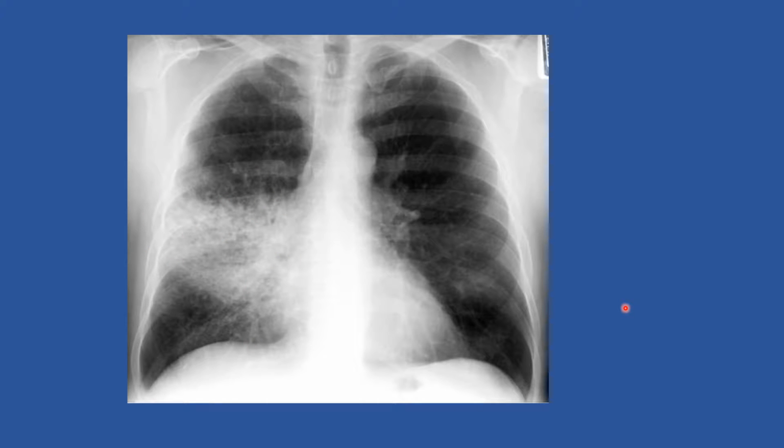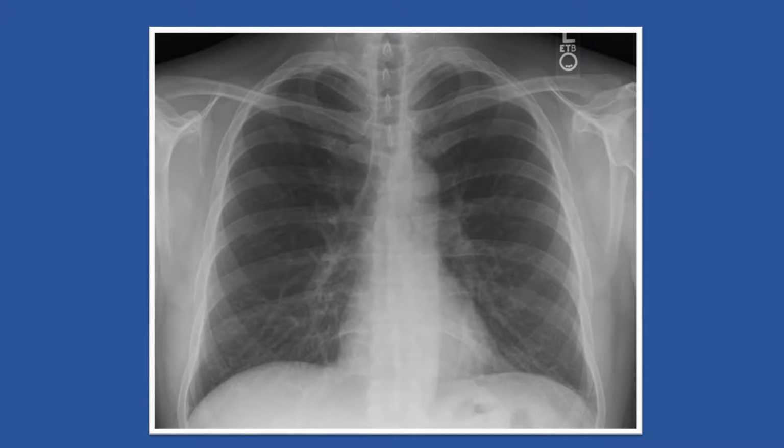This is one of those things that is very common, is that when you really have a good infiltrate, when you really have pneumonia, it's usually going to show up. Lots of times people want to take a relatively normal chest X-ray and almost overinterpret it. They see this infiltrate, imaginary infiltrate, if you will, here. Usually this is either breast tissue, normal markings, and infiltrate is usually going to show up pretty obviously. If it doesn't, then I think it's reasonable to go based on clinical grounds and wait for the radiologist's interpretation.